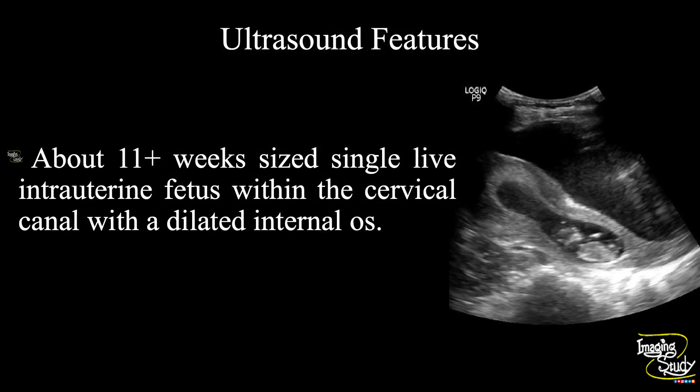In summary, an approximately 11-plus week-sized single live intrauterine fetus is noted within the cervical canal with a dilated internal os, suggesting inevitable abortion.